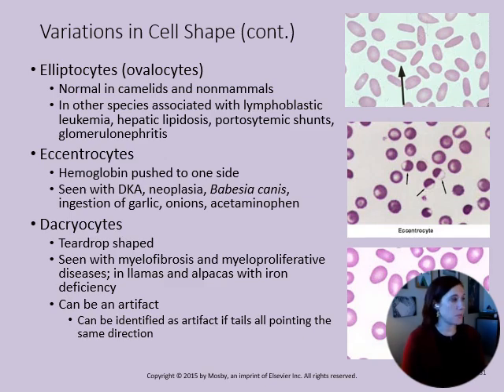One thing that I forgot to mention with your stomatocytes: in lab we talked about that additional resource, eClinPath. If you check that out, you'll have a little bit more of a breakdown of these types of cells and what we can see. For example, for stomatocytes, I didn't put on there what we can see. So here's what we can see. Disorders could be hereditary stomatocytosis in dogs. We see this in Alaskan Malamutes and miniature schnauzers, as well as Peekapoos and Pomeranians.